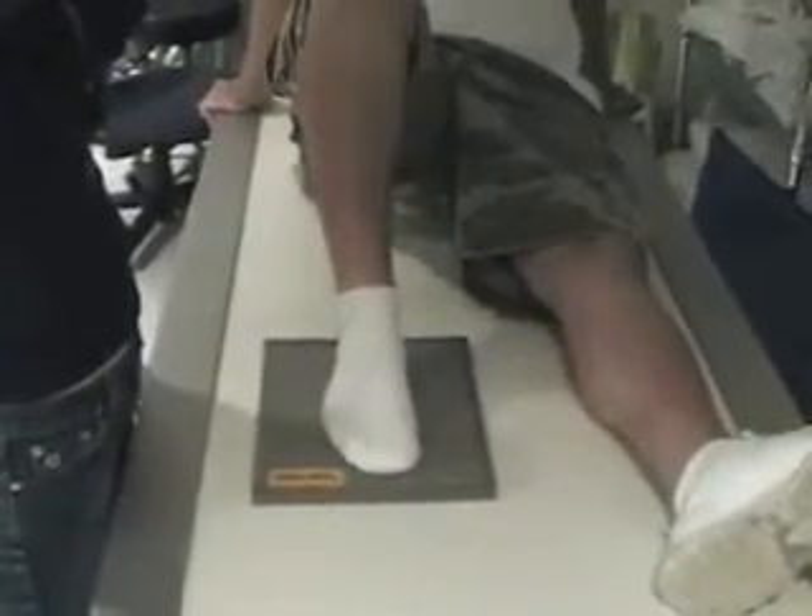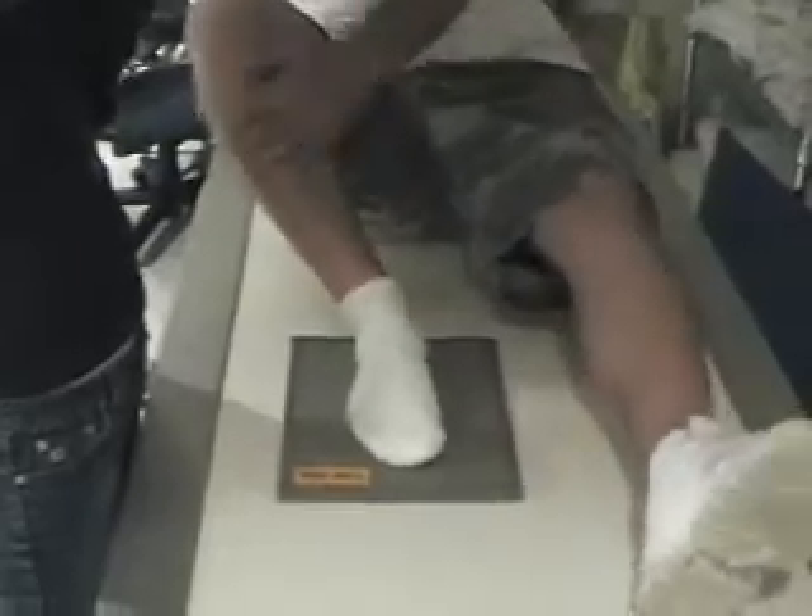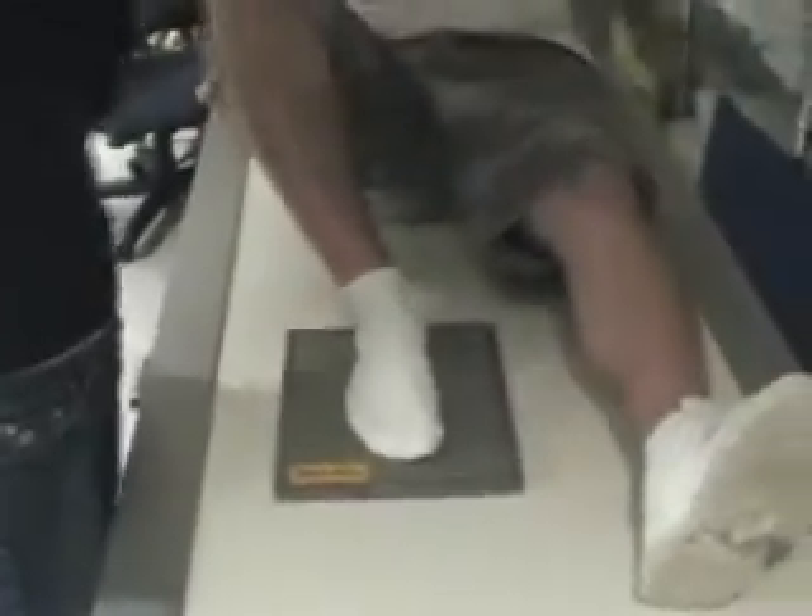So this is what I hate. 15, so that's about 10. Yeah, it's kind of weird. It's not... okay. I'm going to go with that. But how's it going? 10 degrees? What have we got going on here?